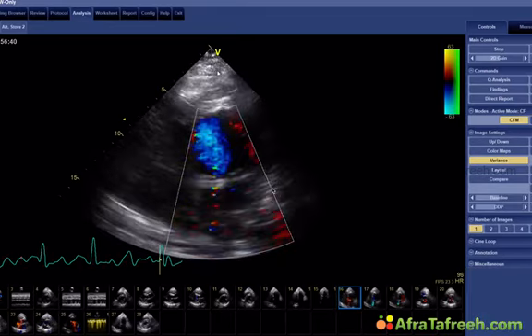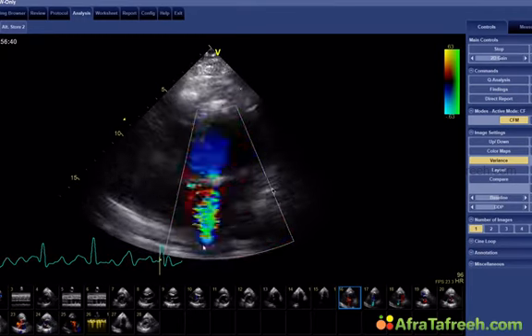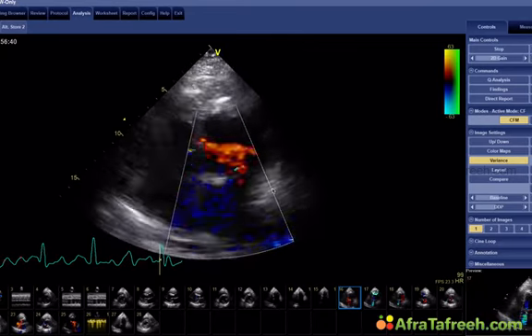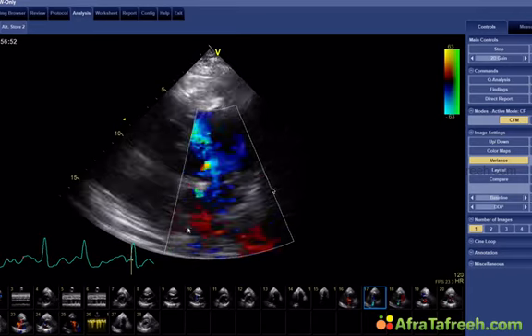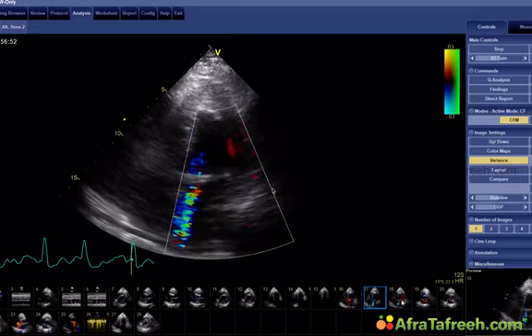And then I saw this. Now, the patient was full of bandages, and it was very difficult to image, but one thing was clear. The patient, again, had mitral regurgitation. And this was very difficult to quantify, but I had the impression this was something that probably could not be left the way it is.